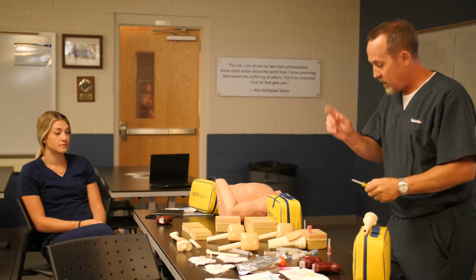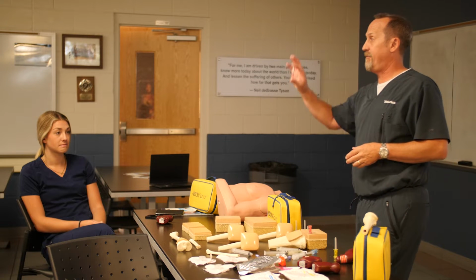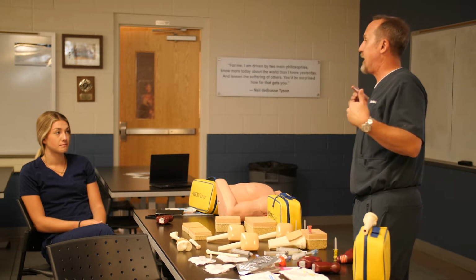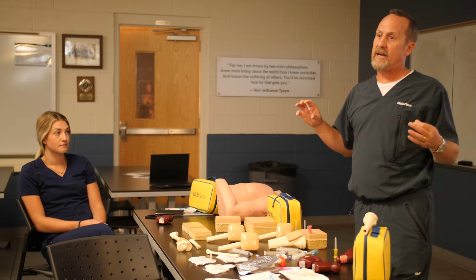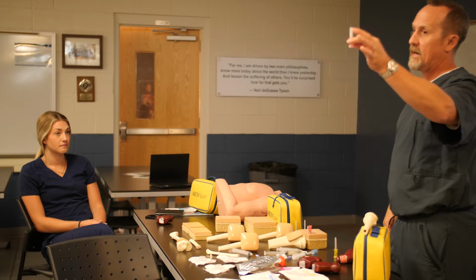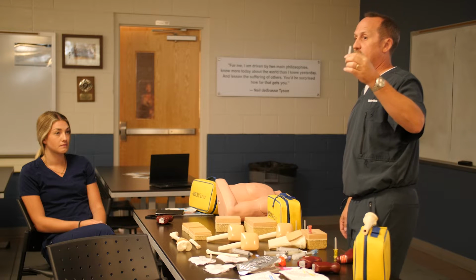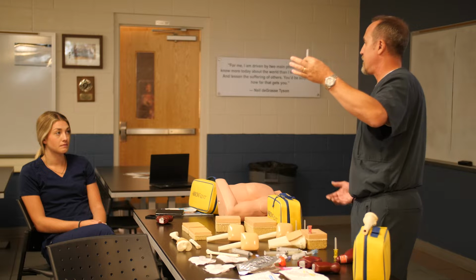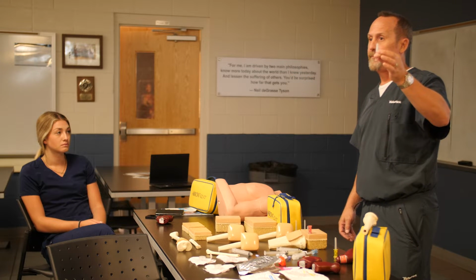Perfect. So, I'm going to jump back a little bit. You have 3 different needle sizes. They're all 15 gauge, so they're going to have the same flow rate depending upon what bone they go into, okay? They're just different lengths to accommodate different anatomy, different tissue thicknesses. So the pink needle that you have is our 15 millimeter needle. It's indicated for 3 kilograms up to 39 kilograms. So you think about that, it's like what, 39 kilograms? It's 80 pounds. An 80-pound patient, it's pretty small, right?